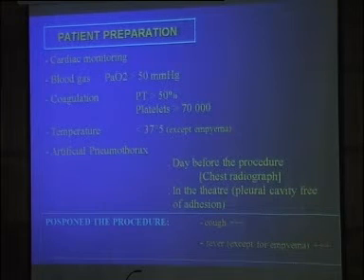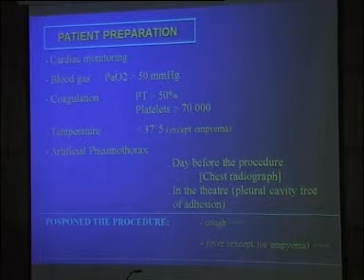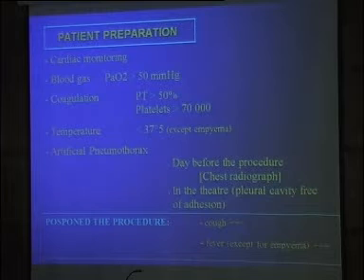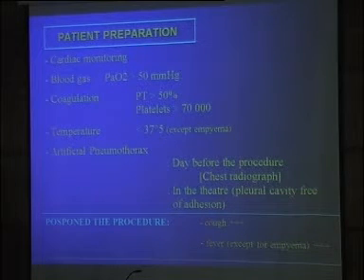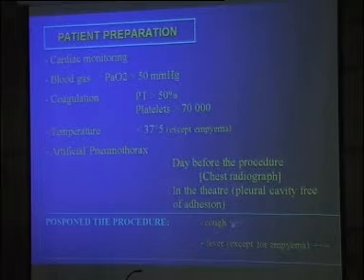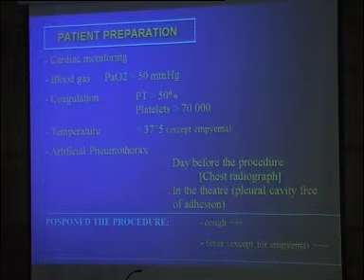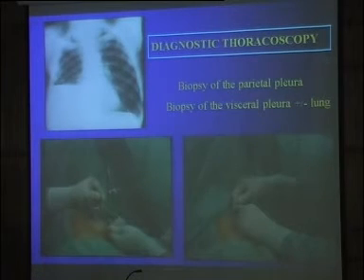And I think 98% of the procedures don't need ultrasonography assessment of the pleura, but it's okay, you can check the pleura using ultrasound. And we postpone the procedure in patients with cough because it's always boring to perform this kind of procedure in such patients, and I was already talking about the fever.